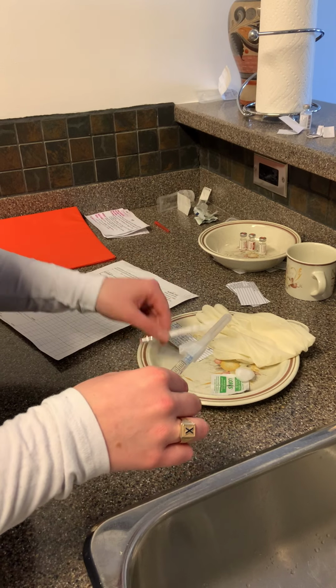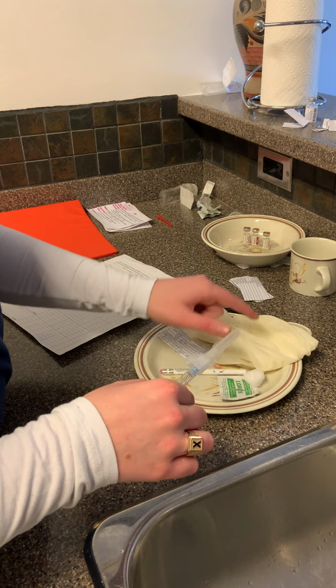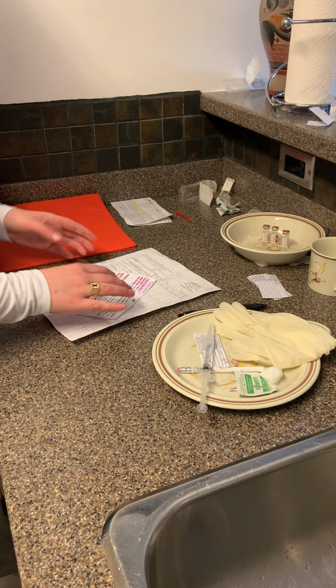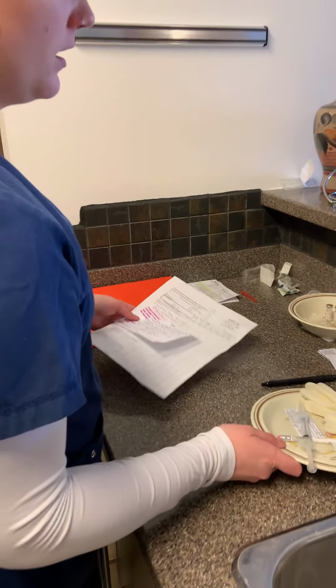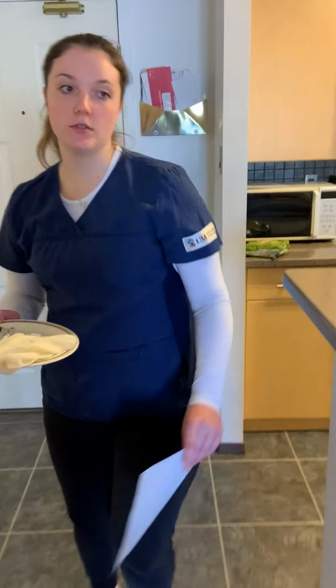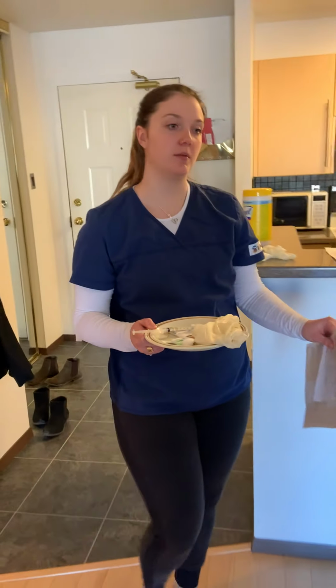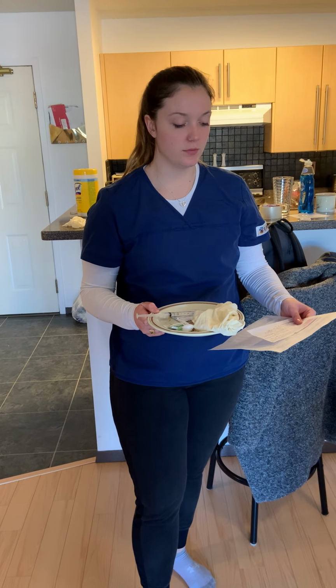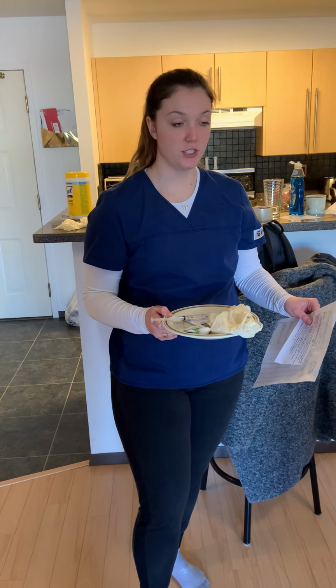So I have my black pen, alcohol swab, cotton puff, gloves, label, and the needle. I'll also take my drug card and the MAR. Then I will go to the bedside. I'll enter the room, knock, knock. Hello, my name is Marchischuk. I'm going to be your student nurse today. I'm here to give you your intramuscular ondansetron injection.